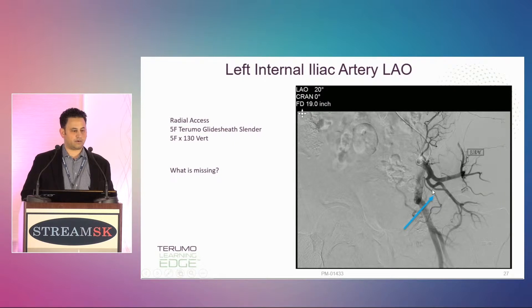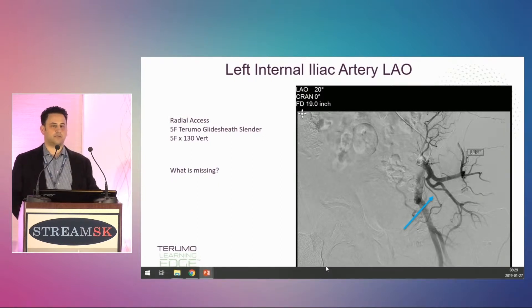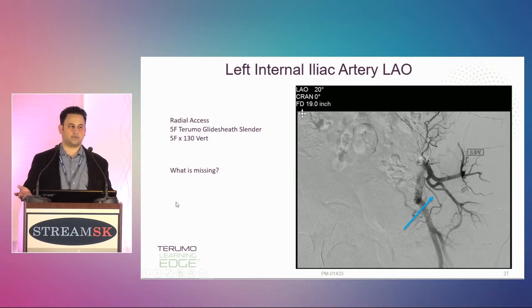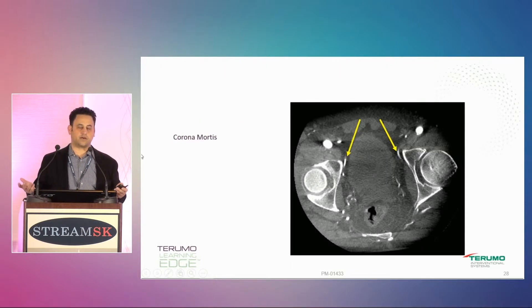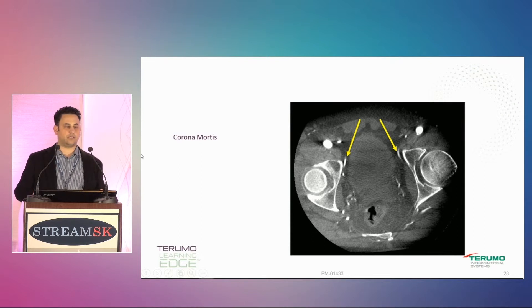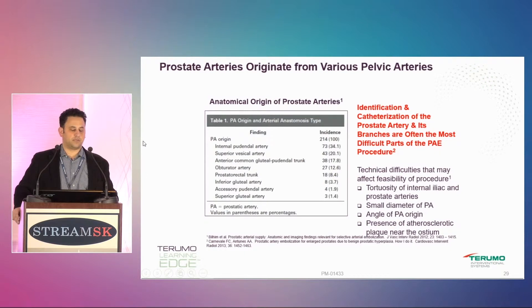You can see the prostate artery coming off here from a VP trunk — superior vesicle, prostate, and the internal pudendal artery. There is some reflux into the external iliac artery. As a review from yesterday: what's missing on this picture? The obturator artery is missing — this is a lot more common than I ever thought. You can see the corona mortis here on both sides.